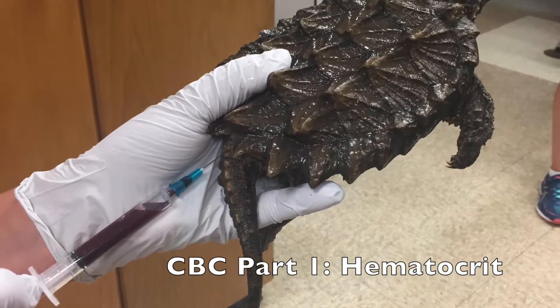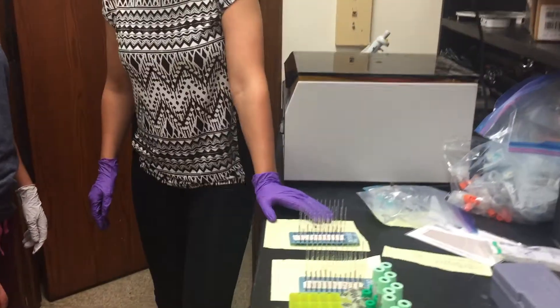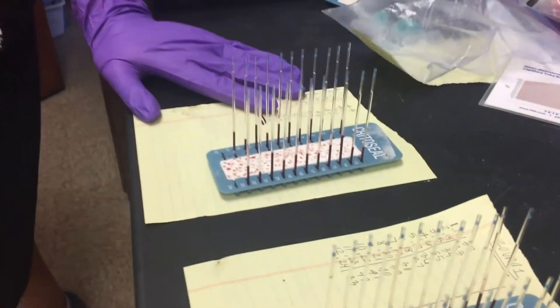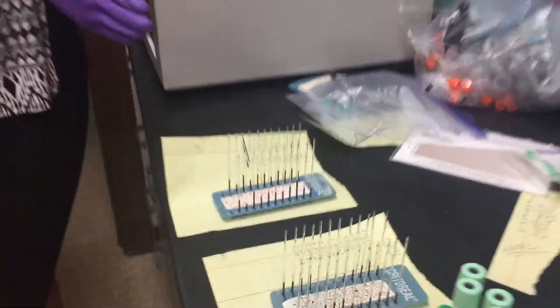The complete blood count is broken down and analyzed with different tests. The first test we run is the hematocrit, which measures the amount of space the red blood cells take up in the blood. For example, if you get a measurement of 38, that means that the red blood cells take up 38% of the total blood volume.